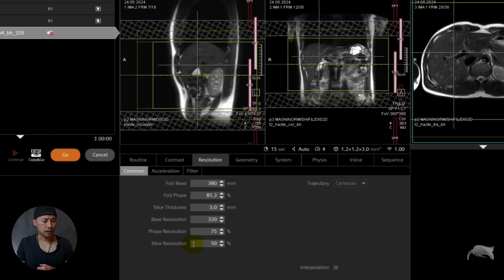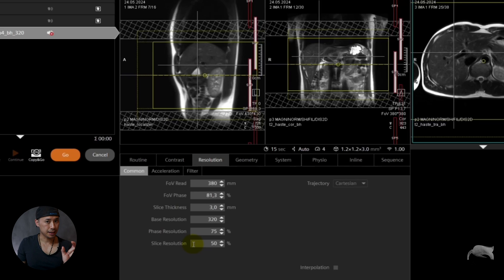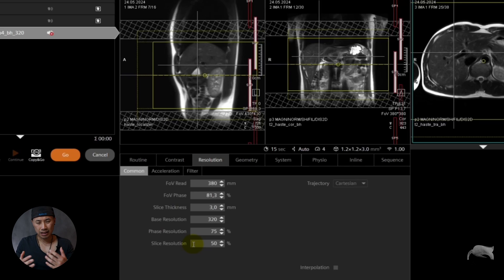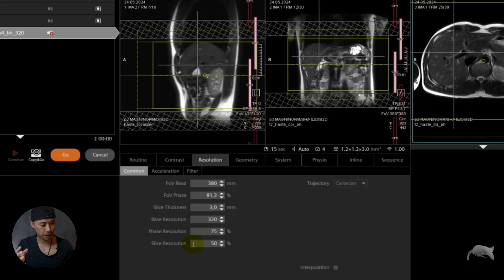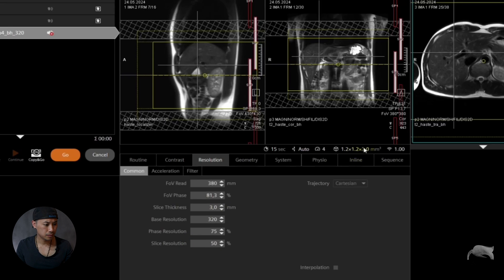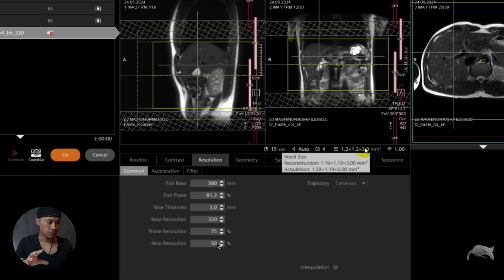Another thing is that if you choose 100%, that will be a true 3 millimeter, no interpolation in slice. But then you also lose a lot of signal. So there's a compensation for that. It's either win or lose, win some you lose some. As you can see I showed you earlier, this is the reason: 6 millimeter. You are acquiring 6 millimeter at 50%, so that means that you interpolate it down to 3 millimeter.